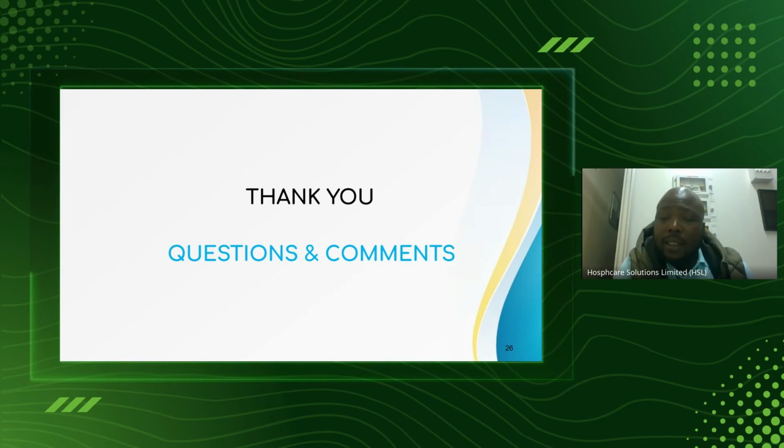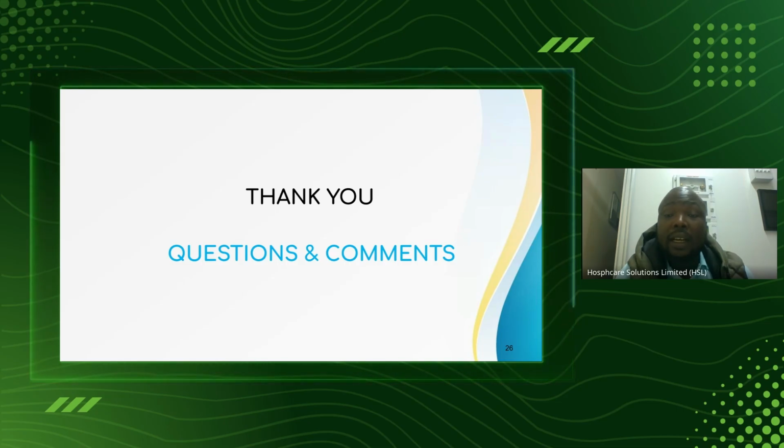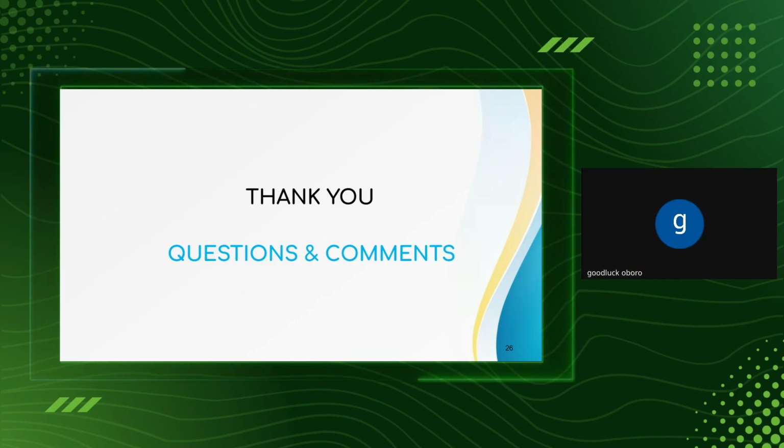Yes, I think that is a challenge most people are facing in the market right now. That problem comes during procurement. Remember I spoke about procurement. When you procure a machine, you need to be sure that the machine you're procuring has availability of spare parts. If the machine can't do its intended function, it becomes very difficult. Ergonomically, there's no way you can put a patient in a supine position without moving, so it really interferes with the patient's posture and spine.